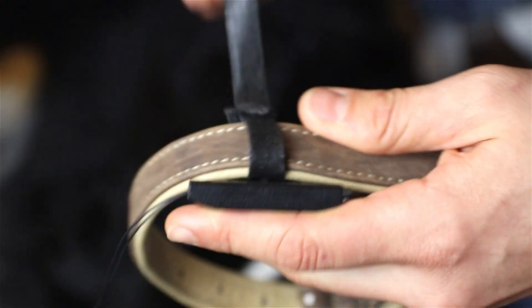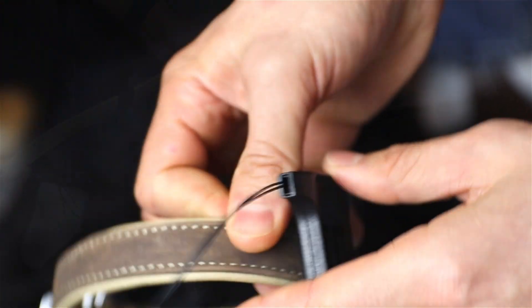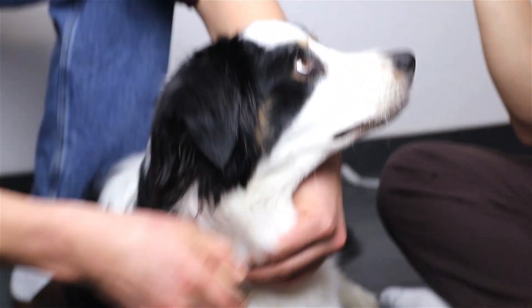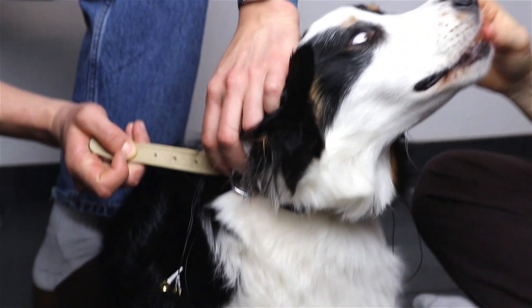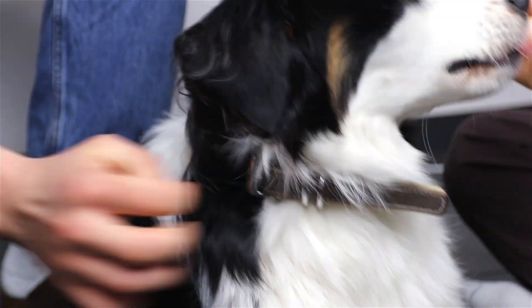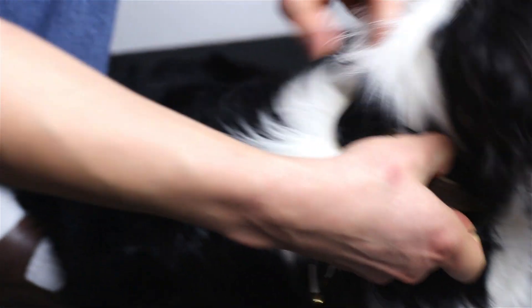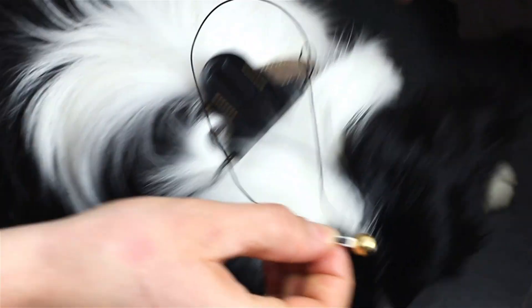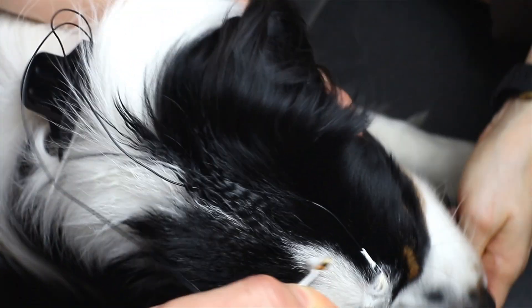Secure the base station to the collar using the Velcro straps, choosing a stable position based on your specific use case, and place the collar on the dog. Apply the gold cup electrodes to the dog's scalp using Elifix gel. For improved signal quality, prepare the skin by cleaning it with alcohol. If necessary, carefully shave the hair to enhance electrode contact.